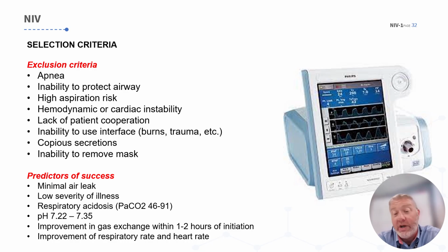Is it worse than the previous one? What changes did they make in between the two blood gas draws? Are you comfortable transporting the patient on the settings that you found them on, based on the last blood gas that was resulted? So a lot of things to keep in mind.